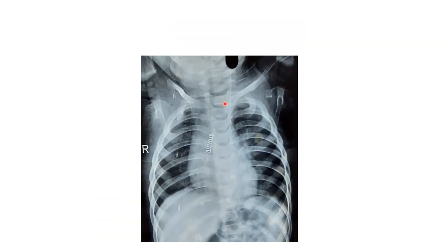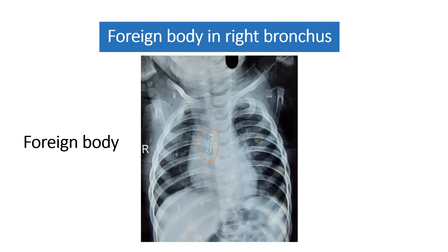In this x-ray, when you trace the trachea, you can see a foreign body present in the right bronchus. The diagnosis for this x-ray is foreign body in the right bronchus.